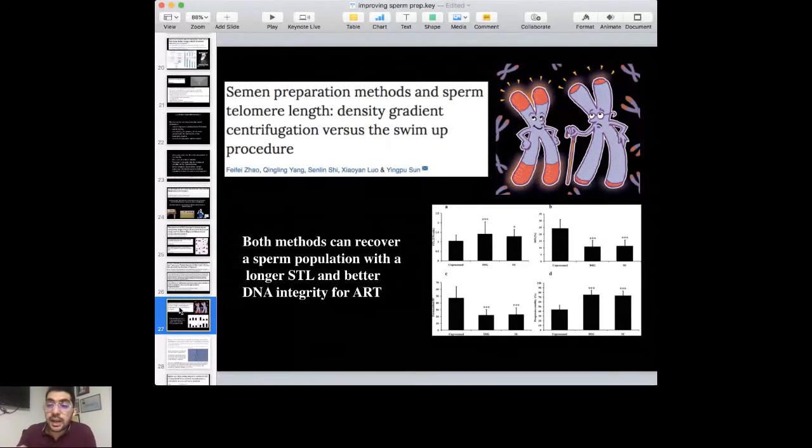And also understand that once you have prepared a semen sample, you're already hyperactivating that sample. And if you wait for a little longer, you're going to cause a premature acrosome reaction, a premature capacitation, which is something you don't want. Because again, what happens during capacitation is that instead of linear motility, the sperm tends to have a figure of eight motility, because this capacitation happens at the ampulla of the fallopian tube, right?